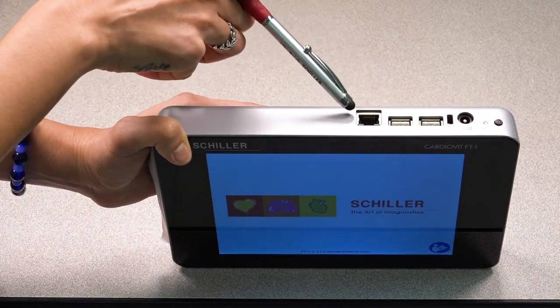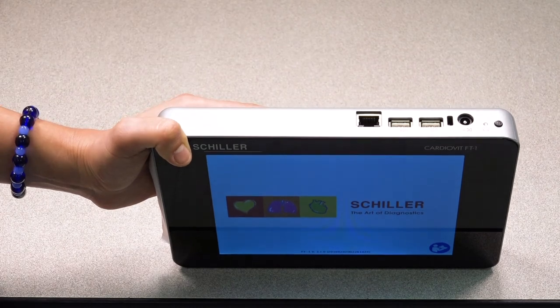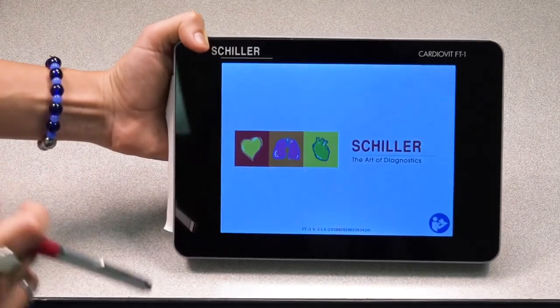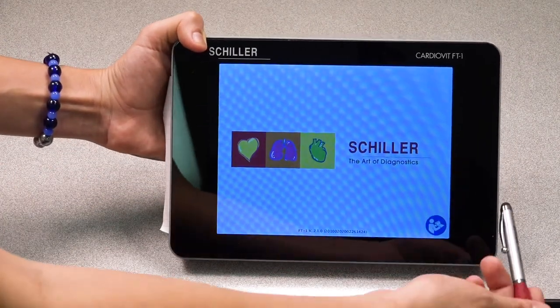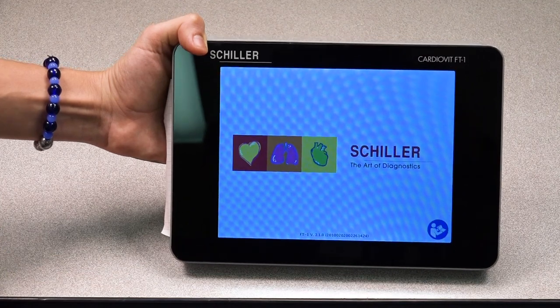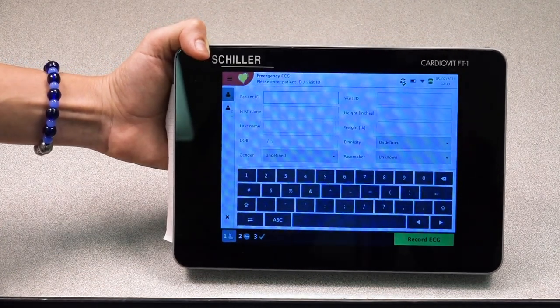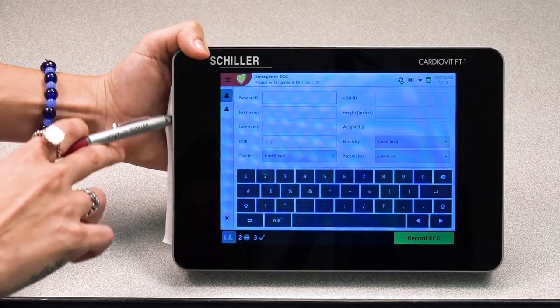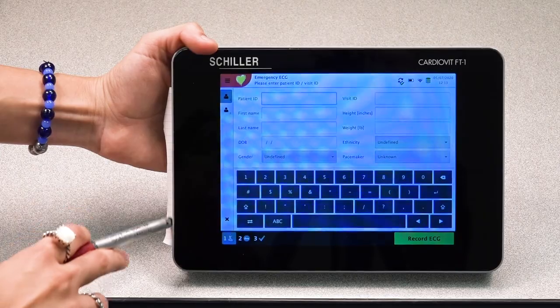You'll also find an Ethernet cable port. On the right side of the unit, you'll find your ECG patient cable port, and on the left side, you'll find your thermal printer.